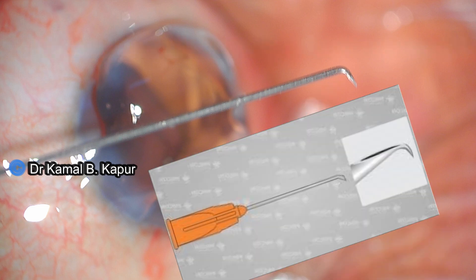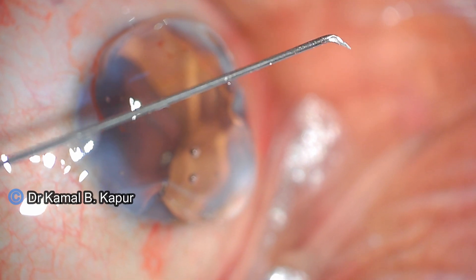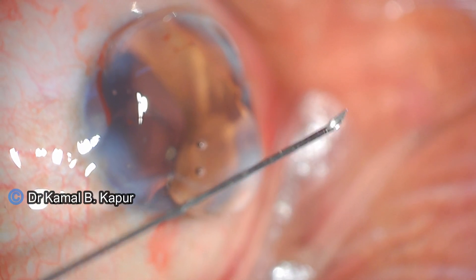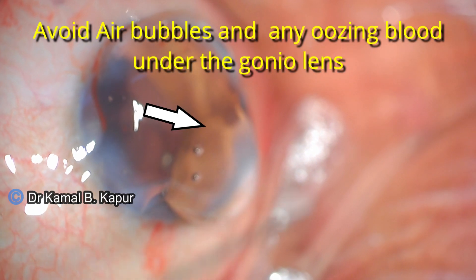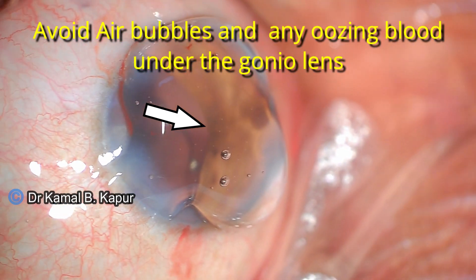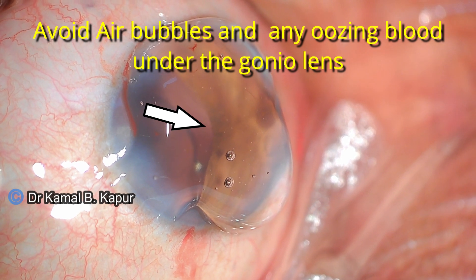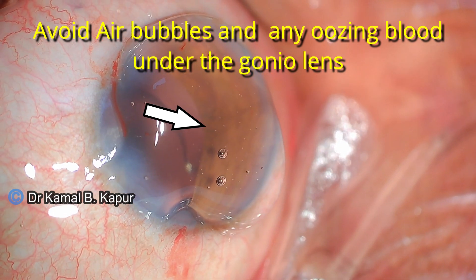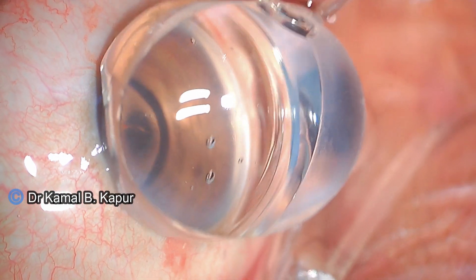We then use a 25-gauge bent angle needle. The needle tip is bent by approximately 70 to 80 degrees — ideally 90 degrees or above can cause some problems, so my preference is a 70 to 80 degree bent tip. The bend is towards the bevel of the needle.